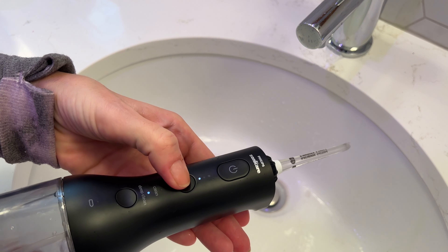This flosser has three different intensity settings — essentially low, medium, and high. There's a decent amount of difference between these settings, with the low setting being extremely gentle while the highest setting actually feels like it's doing more cleaning. After testing each level, I found I preferred the highest intensity setting. There are also two different modes, clean and deep clean, and you can easily switch between them by pressing the mode button on the handle. Clean mode uses a single stream of water, while deep clean alternates regular intensity with a stronger pulse. I found the high-low pulsations seemed more helpful at dislodging any stubborn bits.